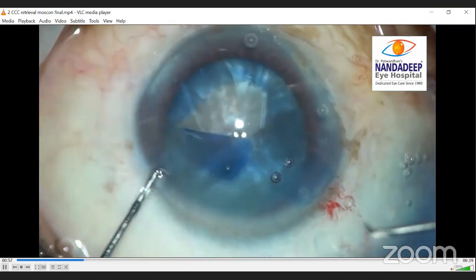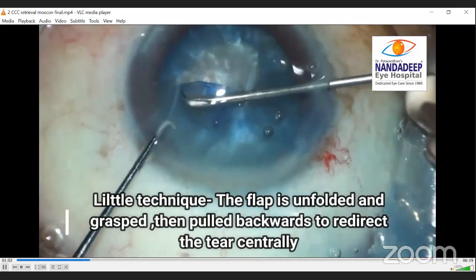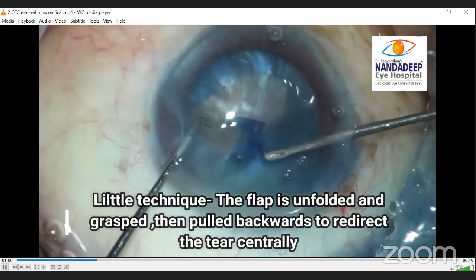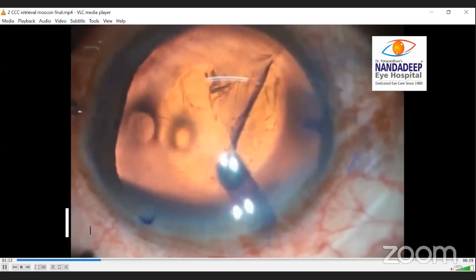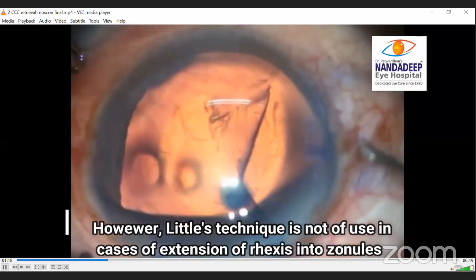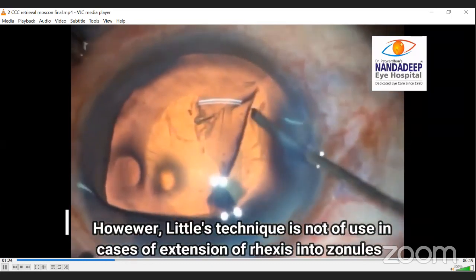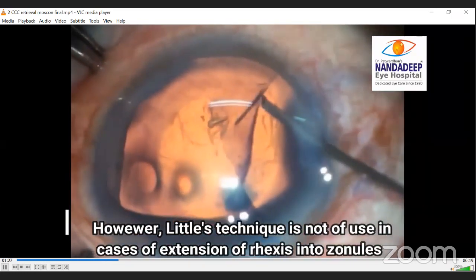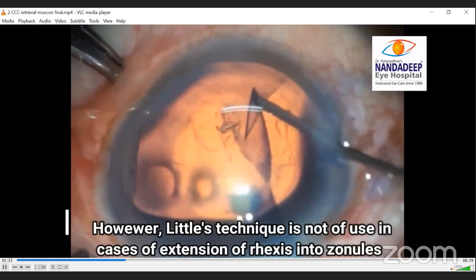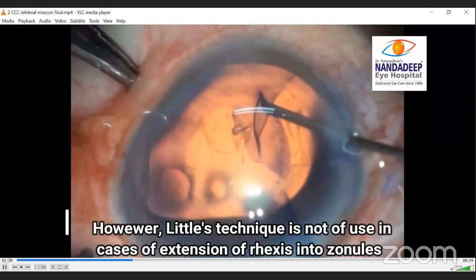So here basically what we are doing is that if the capsulorhexis is going out, we are flattening, unfolding the flap, and then we are pulling it backward rather than tangentially. So once the tear is inside, then we can complete the rhexis. But I found that this Little's technique is not useful when the CCC has already extended into zonules. Then many times, if we try to pull it back by Little's technique, it doesn't come back. So in such cases, the technique that I use is called the quick pull maneuver.